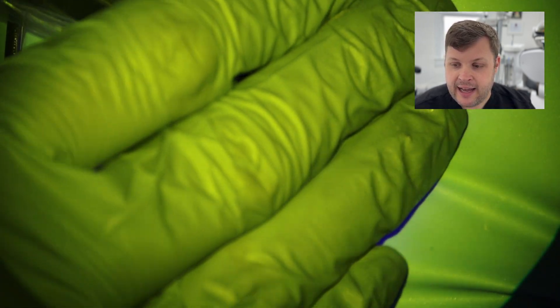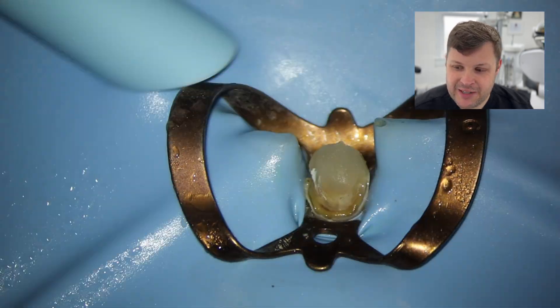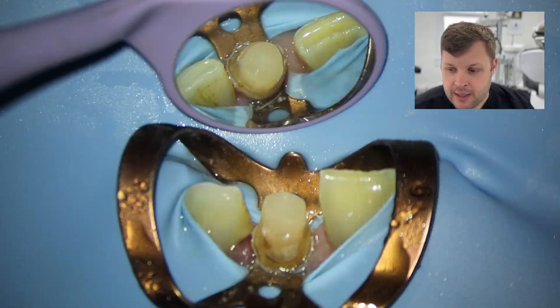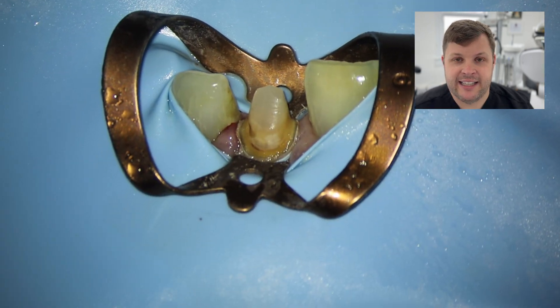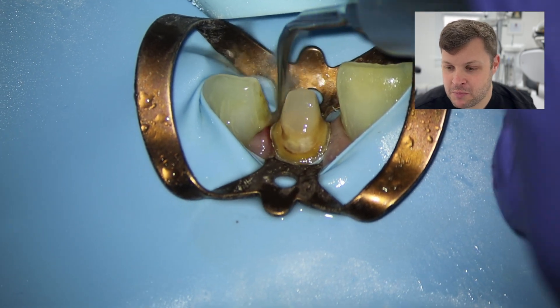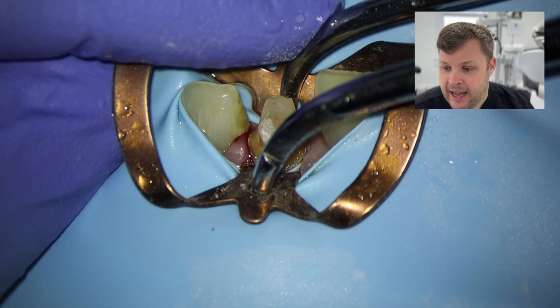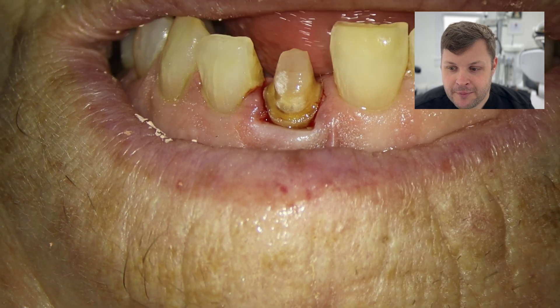I'm building up the core with SDR bulk-flow composite and then doing a very rough crown prep. The rubber dam gets in the way a little so I'm just moving it aside without removing it completely. The tooth has been pretty much shaped already — I just need to shape the core filling and remove any little spurs around the margin using the ultrasonic. I'm not a restorative dentist, so other people's crown prep techniques may differ.